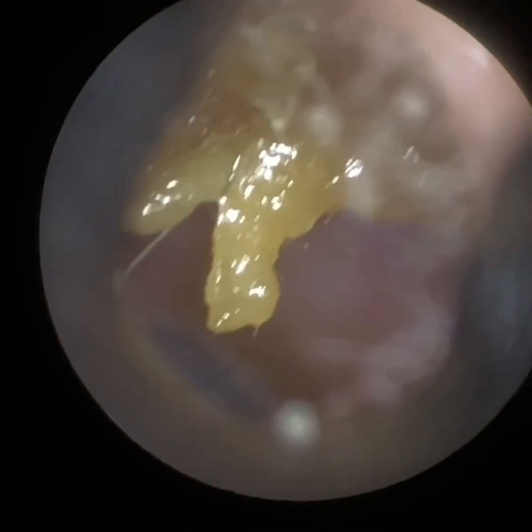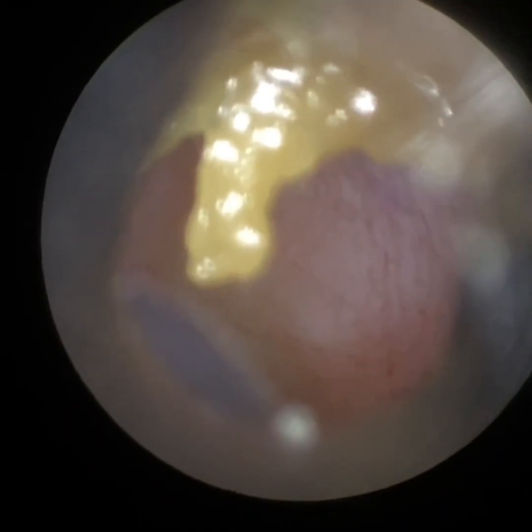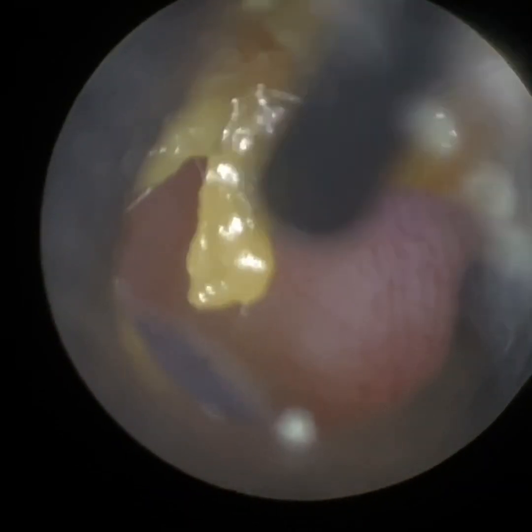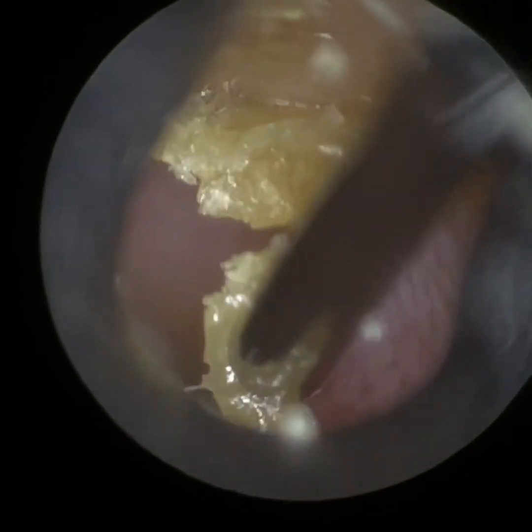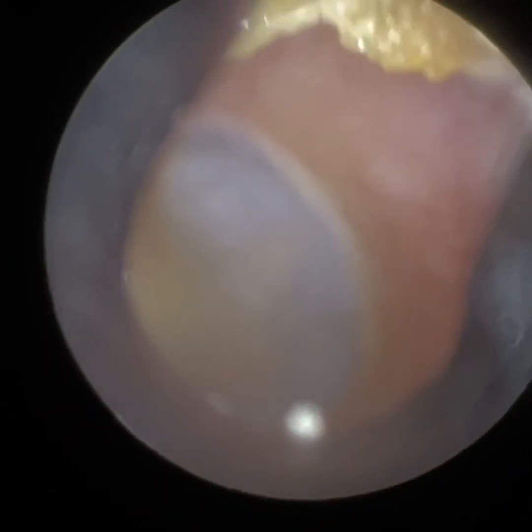Not only has the incus been eroded through infection, but the eardrum has also wrapped itself around the head of the stapes because of negative middle ear pressure due to Eustachian tube dysfunction. So that's the patient's left ear. On the right side, there was just non-occluding dead skin, and just because the patient was here, I said I'd clean this for him as well.